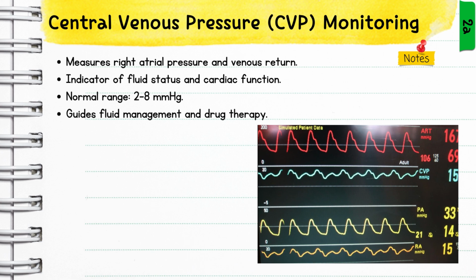Okay, so now let's talk about CVP, or central venous pressure. Okay, I hope you guys are sticking with me now. I know it's a lot of information, but I promise you, once you start interacting with these different monitoring types, you will understand. I promise. So remember, it's beyond just MAP, blood pressure, heart rate, pulse ox. There's so many more vital signs you could be monitoring. So CVP, it's one of my favorites.